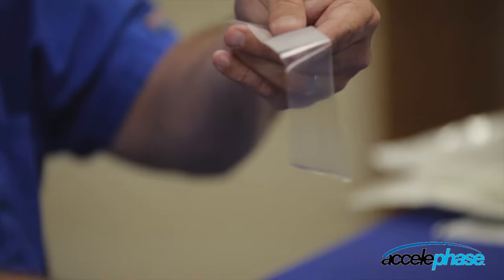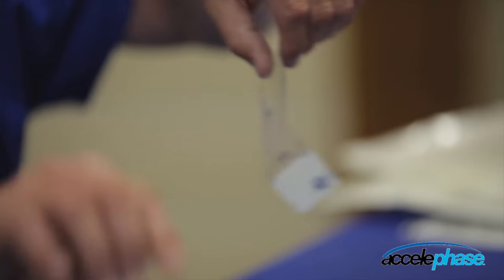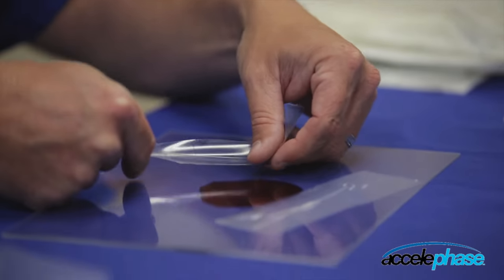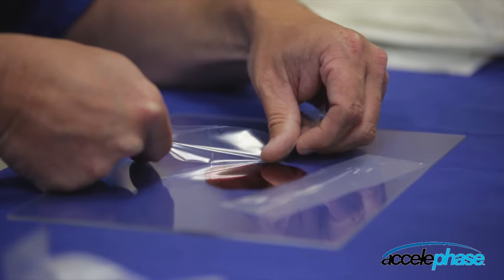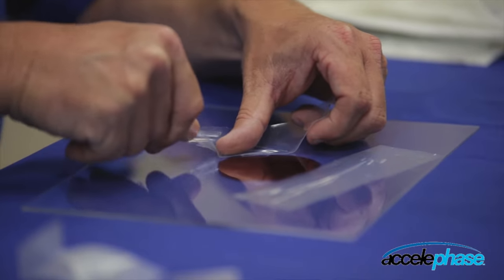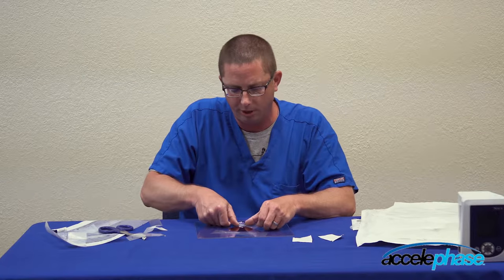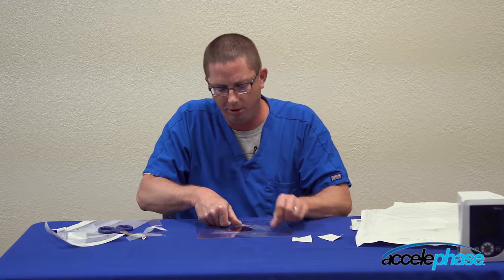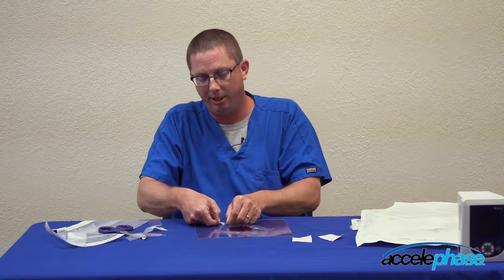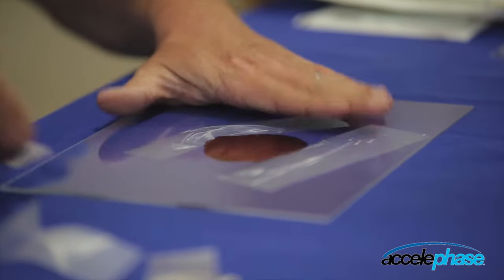Remove the number one tab, remove the second tab, and continue walking this around the peri-wound area. This just offers the protection for the peri-wound area, so in case foam does come in contact with good skin, it does not cause damage to the good skin.